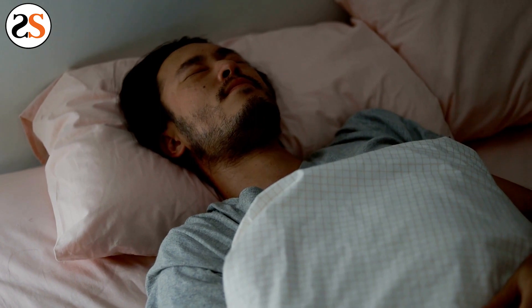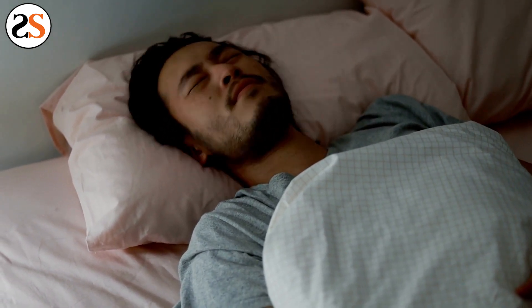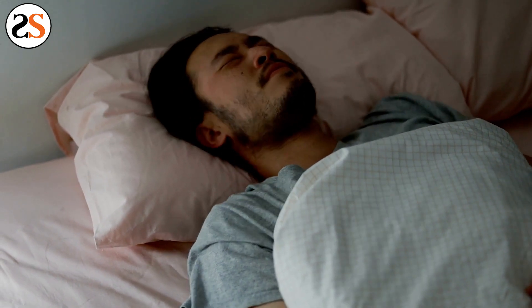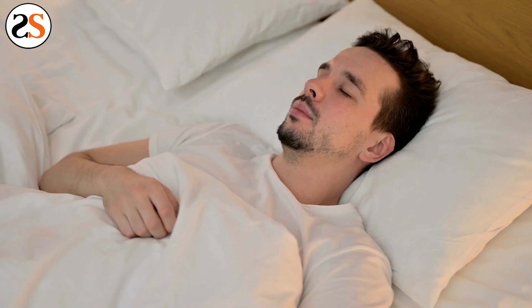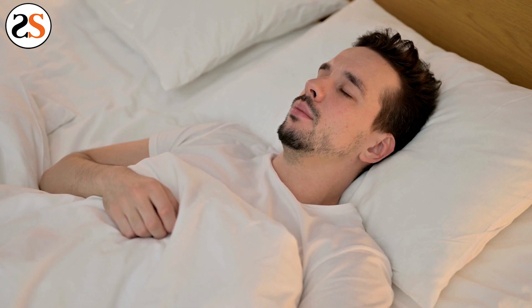What if you have a bite splint but you don't wear it? People who suffer from teeth grinding can tell you how much better they sleep with a night guard. Custom grinding guards are crafted for comfort and protection, and wearing one will give you instant relief as you sleep peacefully throughout the night.